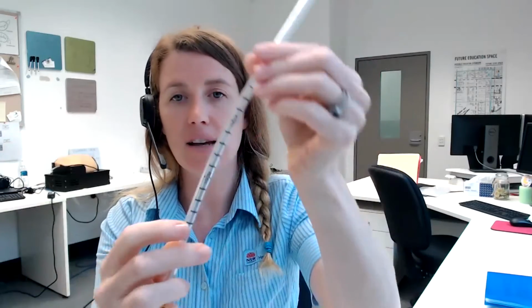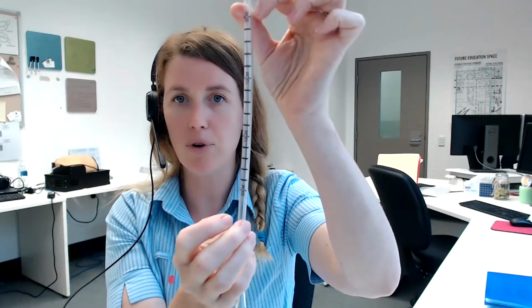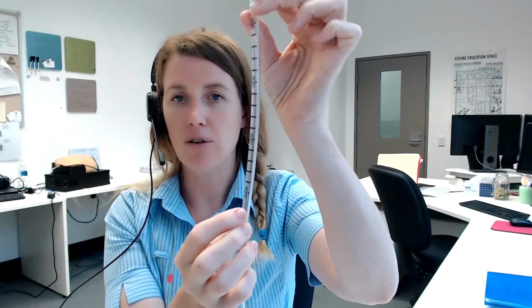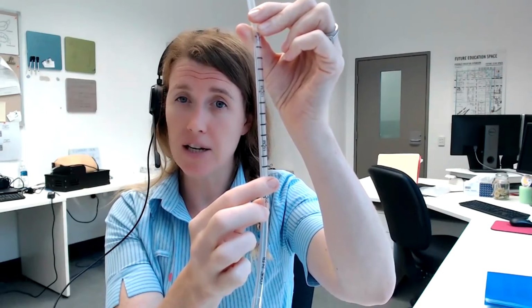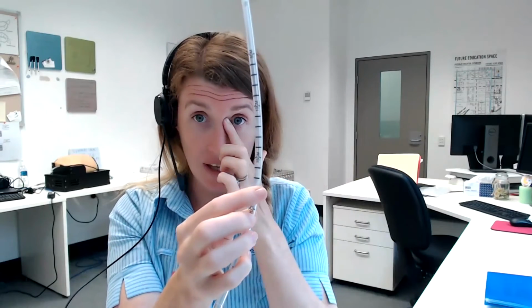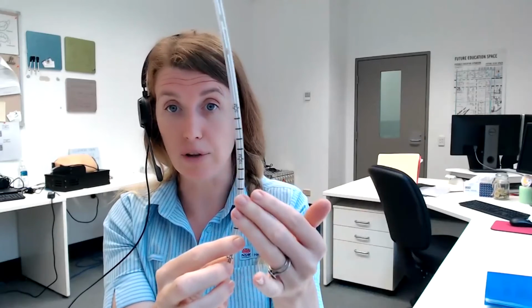And you can see down the side here, you've got markings, centimetre markings, and it's really important during your assessment that you're aware of at what depth this is inserted into the patient's chest wall. So that would be one of the things you would assess when doing a physical assessment. And then if something happened to your drain, you would ensure that it's not migrated either in or out.